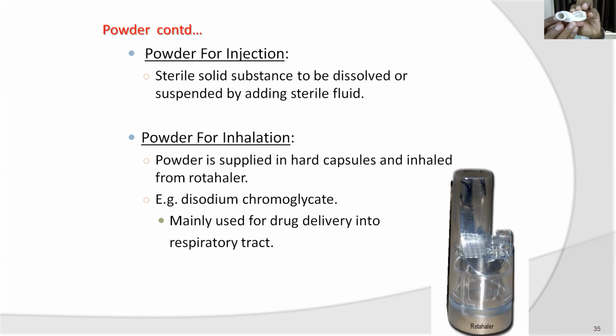There are two buttons, and when you press, two pin-like structures come out. These pins puncture the capsule, and then the drug comes out. When you inhale, a rotating sound of the capsule comes, and the drug goes inside. This is known as a Rotahaler.